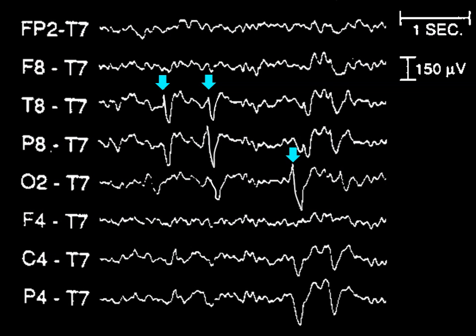If a tracing recorded using a common electrode referential montage has no phase reversal as the epoch in this frame, we can make two sound assumptions. One is that the reference electrode is either the maximum or the minimum of the electrical field for that given moment.